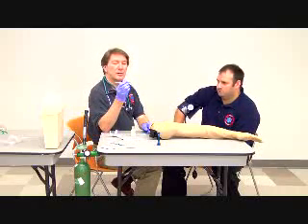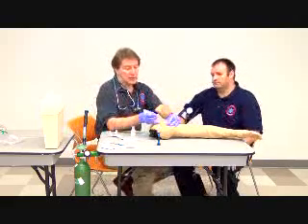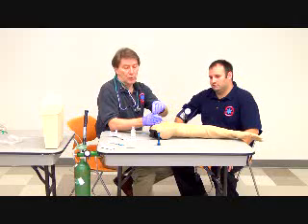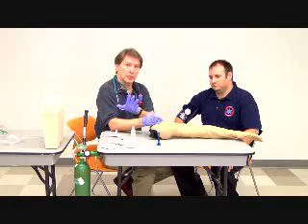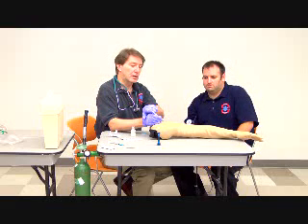I'm going to make sure that the bevel is pointed up toward the ceiling. I'm going to pinch up some fatty tissue. I'm going to inject, pull back to make sure that I don't get a blood return. If you do get a blood return, simply withdraw the needle, start all over. If you don't get any blood returning, go ahead and slowly inject your medication.